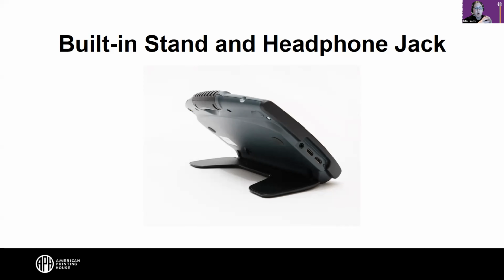Great. And someone had asked, once the stand is deployed, can I then move the camera into self view? Yes, you can use the camera in any of the positions, in any of the different views with the stand opened or closed. Great. So while it does automatically rotate to reading view, I can use it for distance view, self-care view, etc. Yep, you could close the stand and you can put it into the near reading view, the distance, self view, writing. You can have all the different rotations and positions of that camera with the stand open or closed.